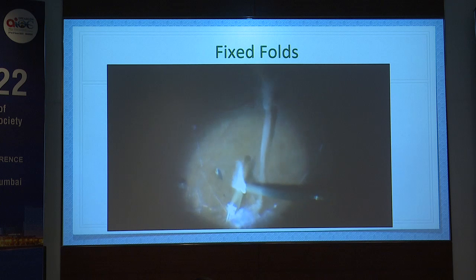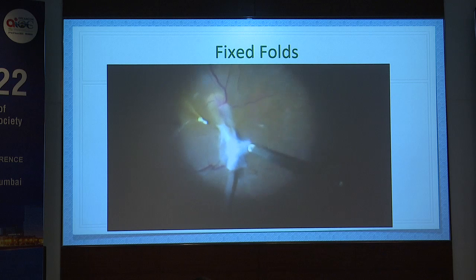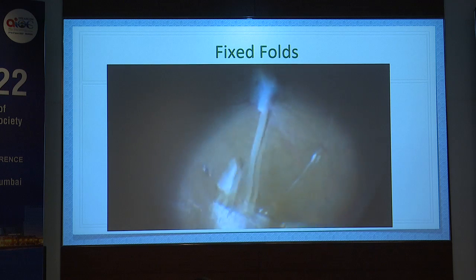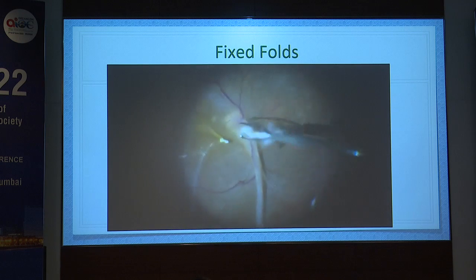Now, many times you would cause a retinal hole or a tear in such cases when you're doing the dissection, but if you do that, make sure that there is no residual vitreous band that is connecting your regma to that particular place. Otherwise the traction is just going to cause a recurrent retinal detachment.